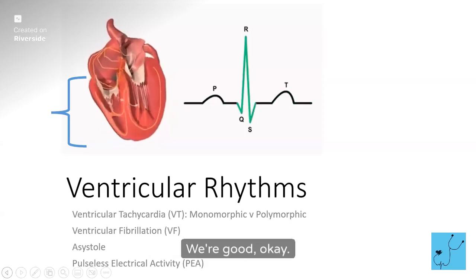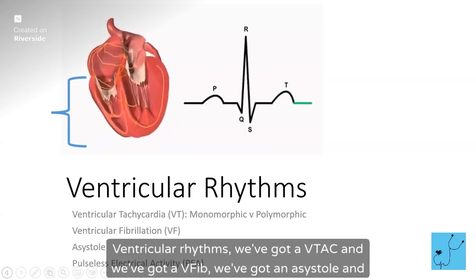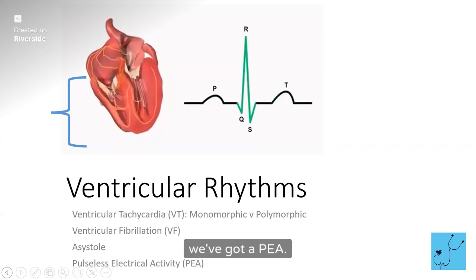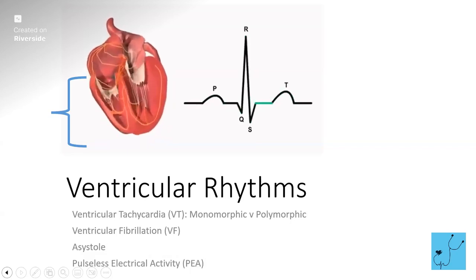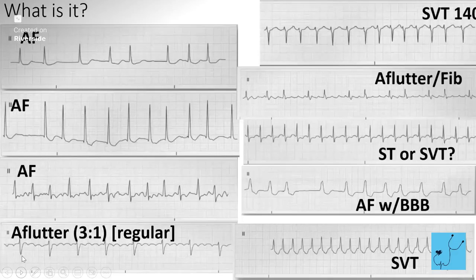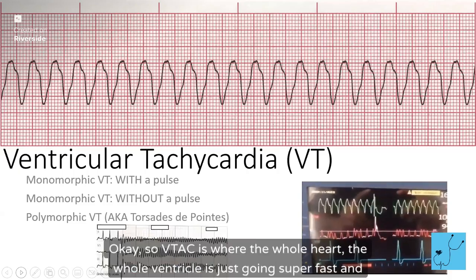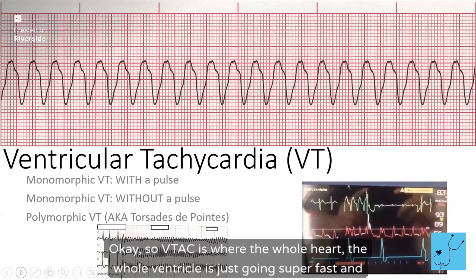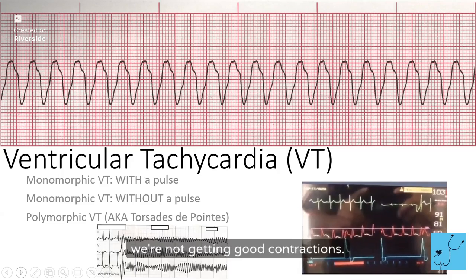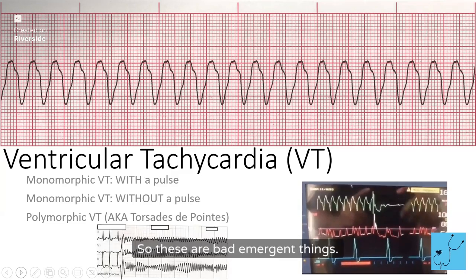Okay. Ventricular rhythms. We've got a VTAC and we've got a VFib. We've got an asystole and we've got a PEA. These ones are maybe a little more straightforward. VTAC is where the whole ventricle is just going super fast and we're not getting good contractions. We're not getting good oxygen to our heart. So these are bad emergent things.